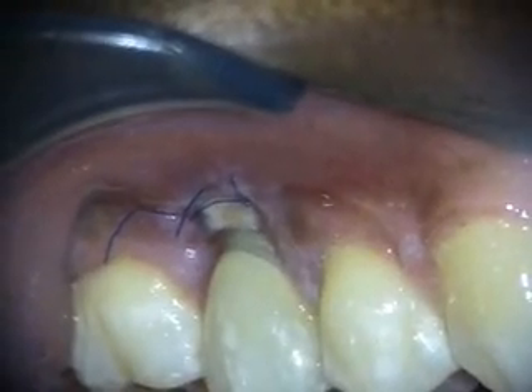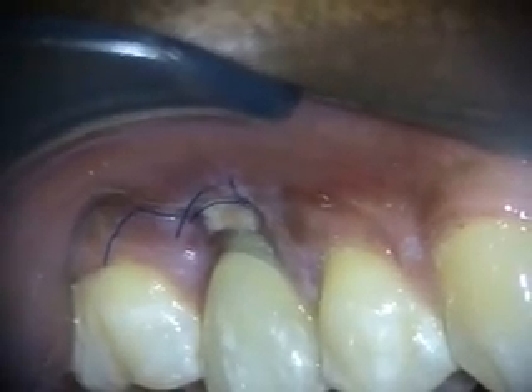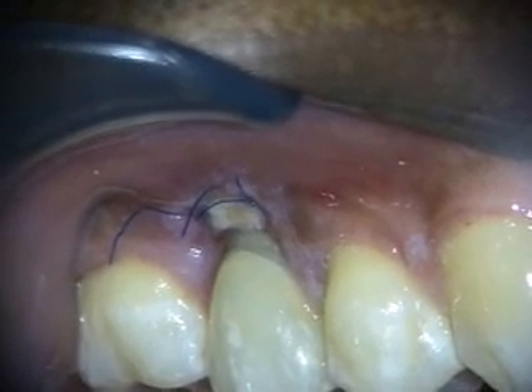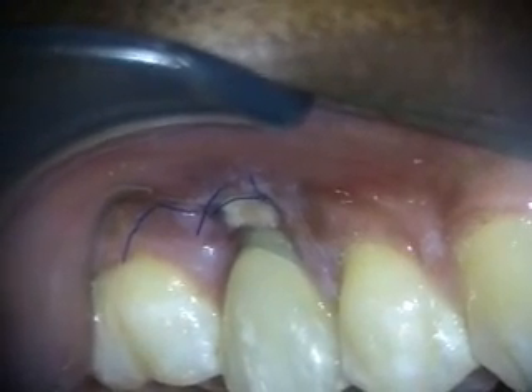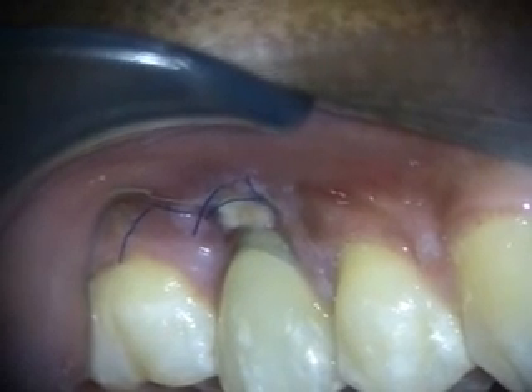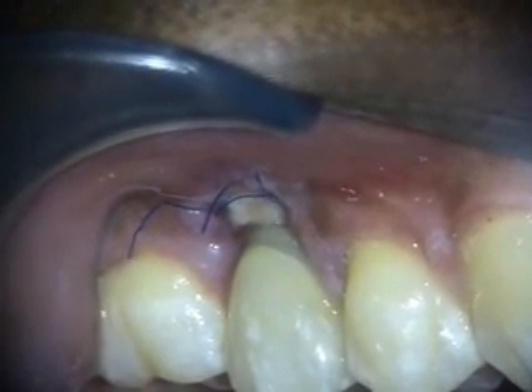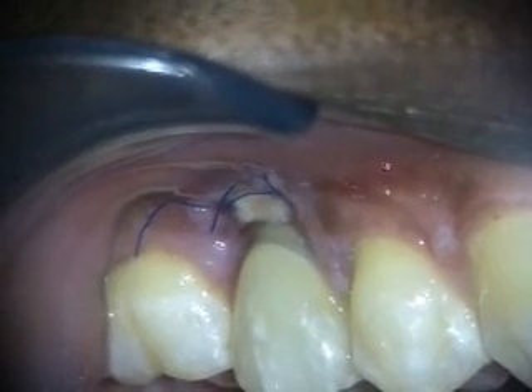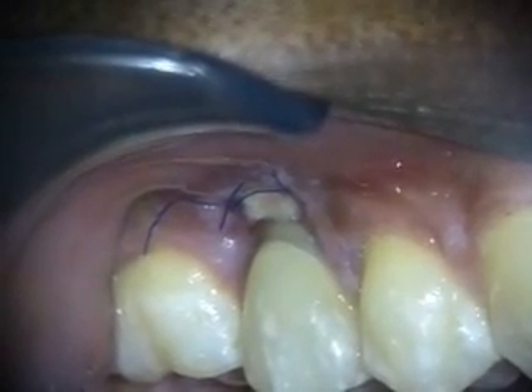Okay, this is a two-week healing. We put some Perio-Pac on there, and what I want to do is keep packing it to keep that exposed alloderm covered. What I did was left some alloderm open so that we can see if the soft tissue is going to granulate into it, so we're going to pack it again.